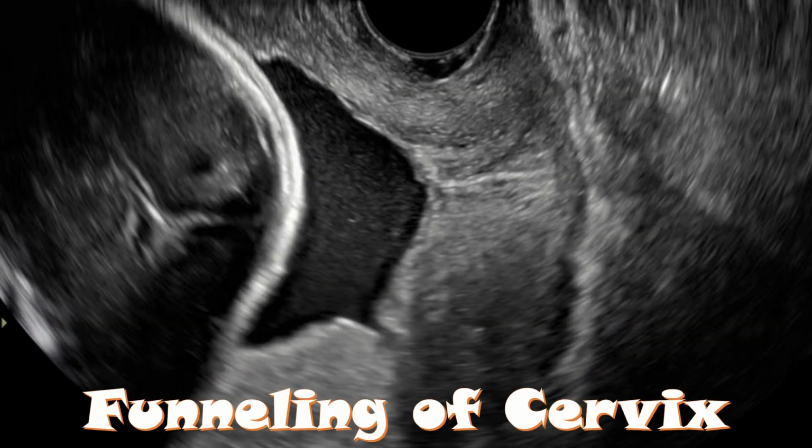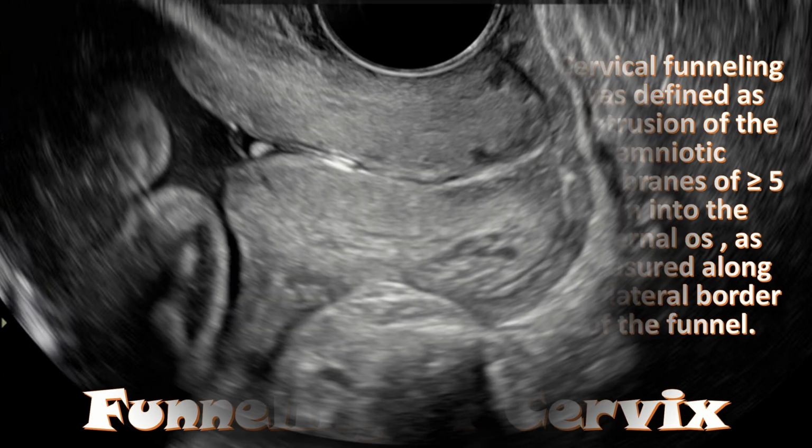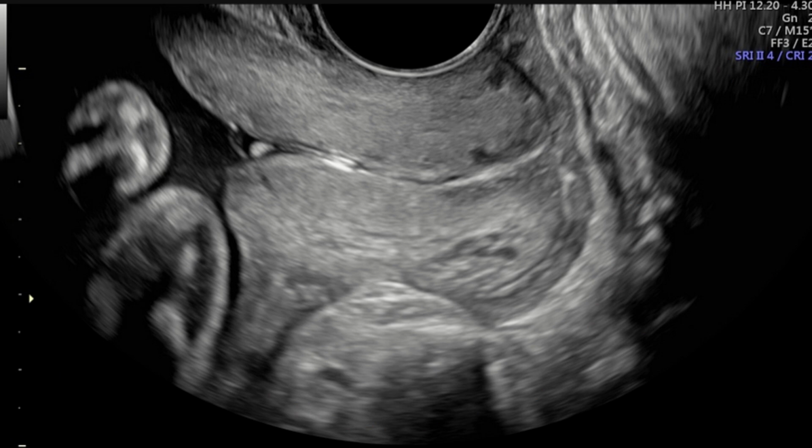Funneling of the cervix. Cervical funneling was defined as protrusion of the amniotic membranes of equal to or more than 5 mm into the internal os as measured along the lateral border of the funnel. This finding is usually accompanied by short cervical length, defined as less than 25 mm.